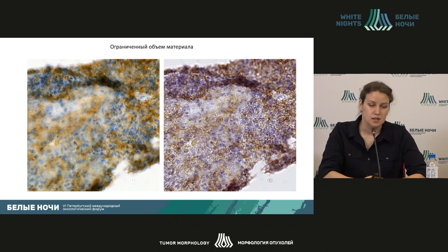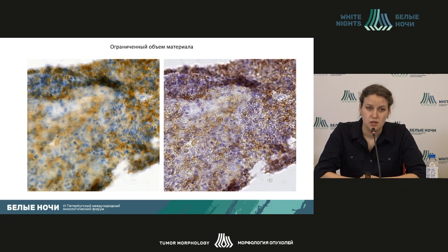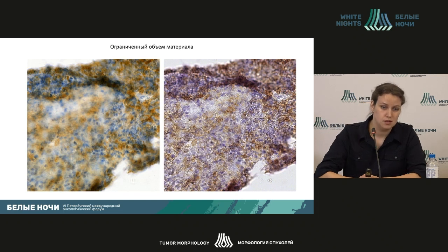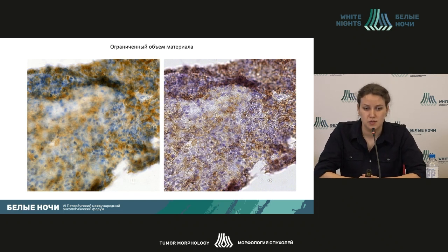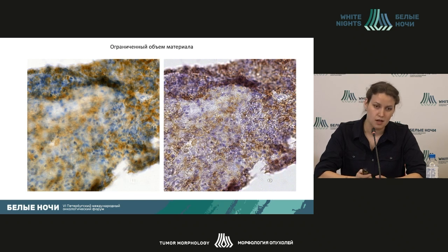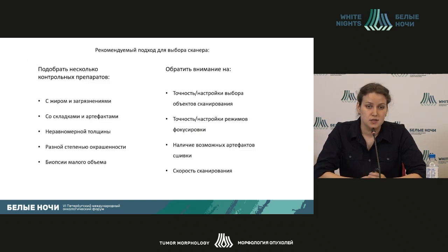That is the way it looks when magnified — on the right-hand side, that is the close-up. You can see this is a small, crumpled biopsy specimen. It is artificially stitched in such a way that it looks contrasting and clear-cut — this is a CD30 stain in this case. You will be able, using your own judgment, to opt for this or that image depending on which is more appealing and diagnostically useful to you.